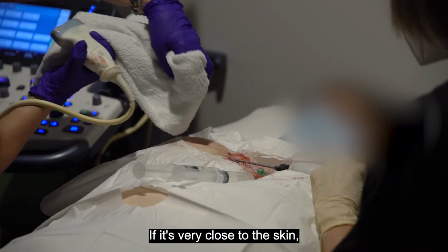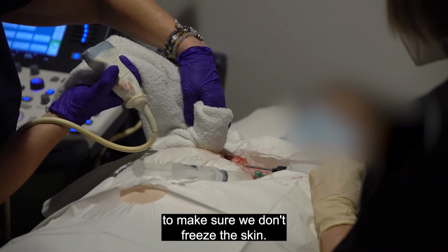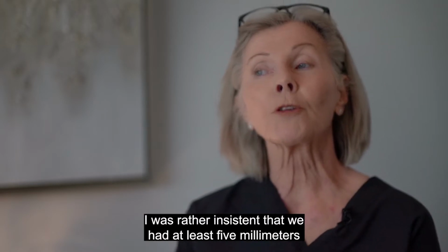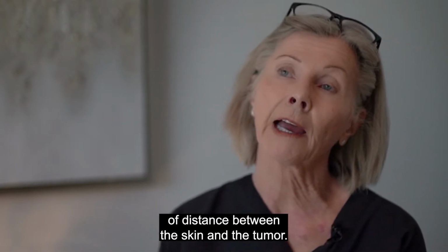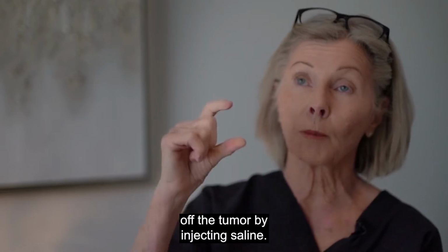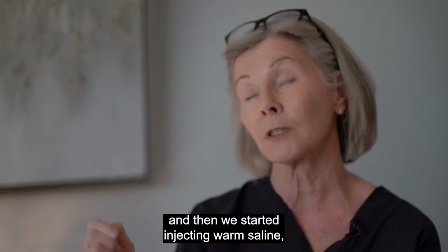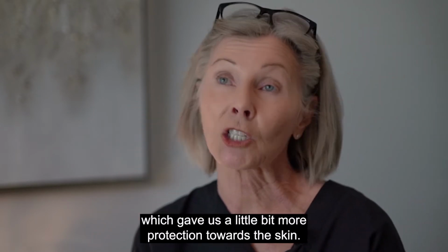If it's very close to the skin, we have to protect the skin with warm saline and warm compresses on top to make sure we don't freeze the skin. So when I started doing it, I was rather insistent that we had at least 5 millimeters of distance between the skin and the tumor, because we knew we could dissect the skin off the tumor by injecting saline. I started off with just injecting saline, and then we started injecting warm saline, which gave us a little bit more protection towards the skin.